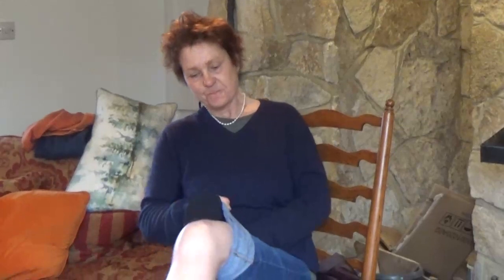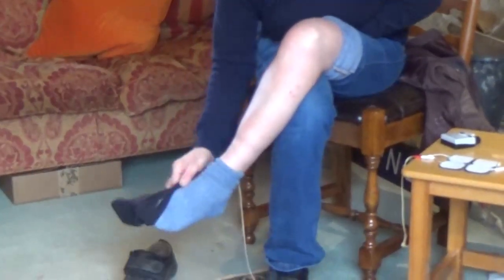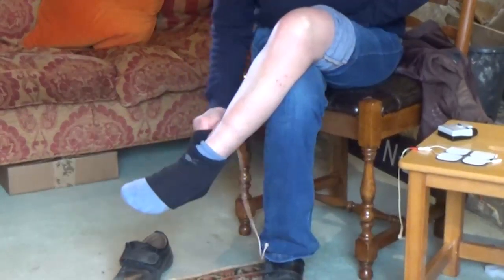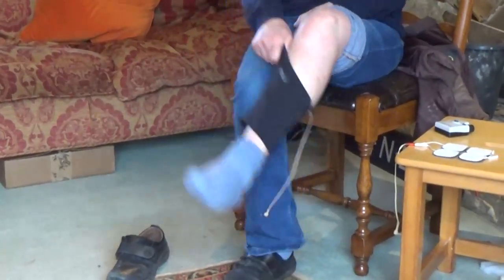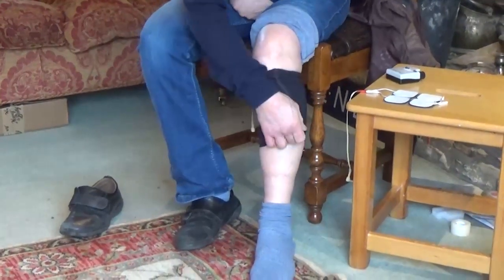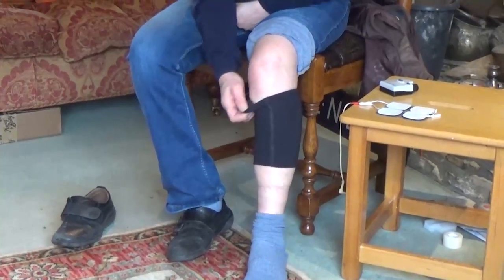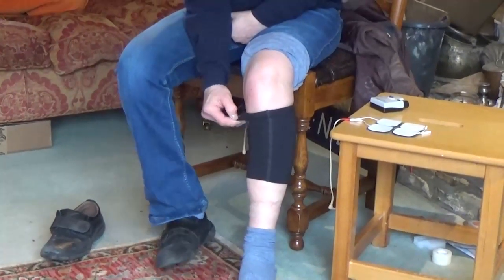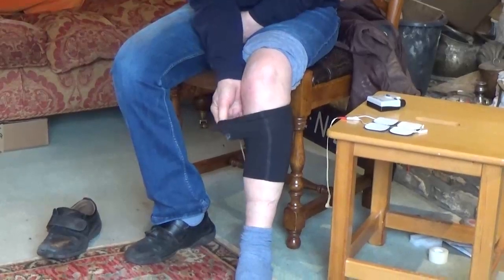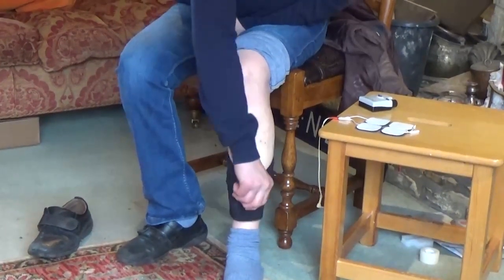I'm going to show you how I put everything on when I first get up in the morning. This little sock has got an inner pouch to it and I would do this first. I would have the seam running down the main bone on my leg, and then the inner pouch is here, which you'll see is very useful.